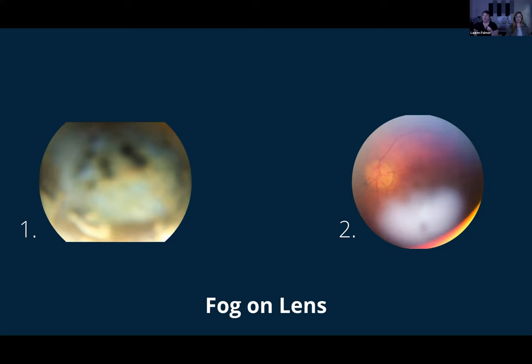Just be mindful that they're not placing their forefinger up underneath their eye, because that will interfere with the seal of the eye cup. If you're comfortable with it and your organization is comfortable with it, you can also just have the patient remove their mask for the exam. That's completely up to you, definitely based on your comfort and your organizational guidelines.